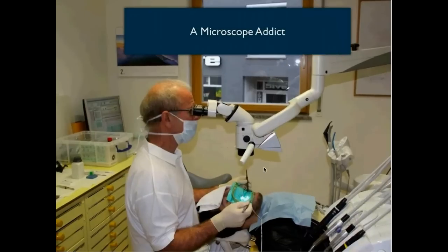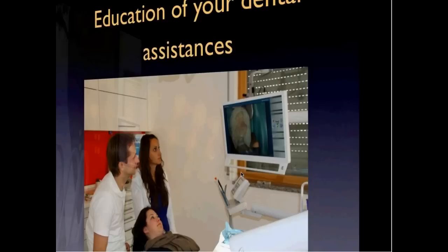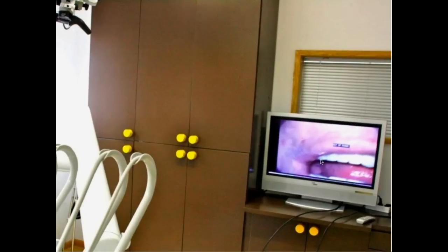I confess I'm a microscope addict, and I'm afraid I infected my successor. He uses the microscope almost as much as I do, and he is instructing his assistants and telling them what's on, what this picture means, and using the microscope for instructing his patients and getting better assistance, because your assistants are looking at the picture on the monitor, and when you're working, they see how far you are in your treatment, and they will always be 1 step ahead.